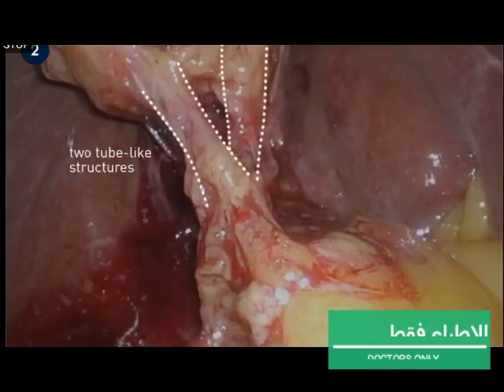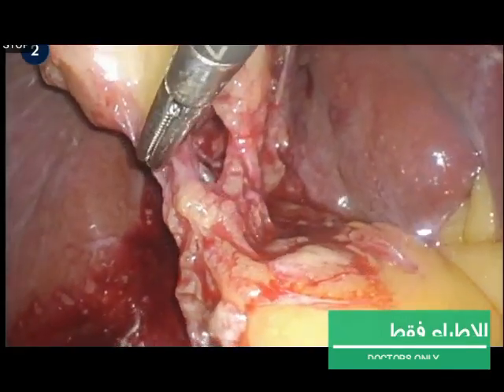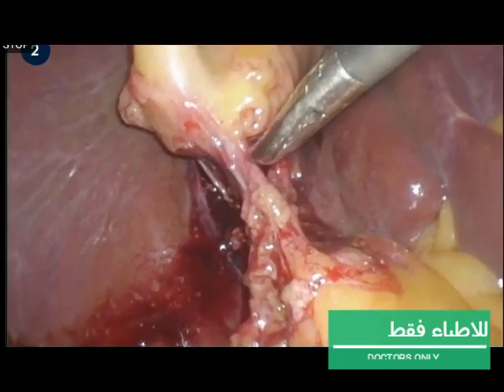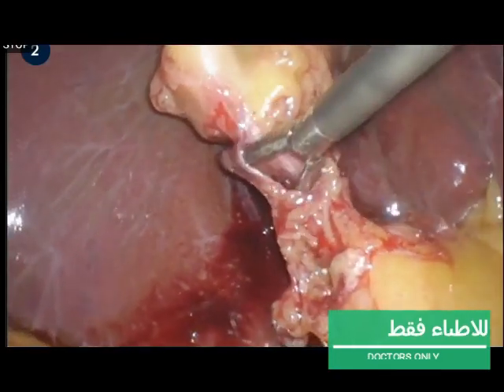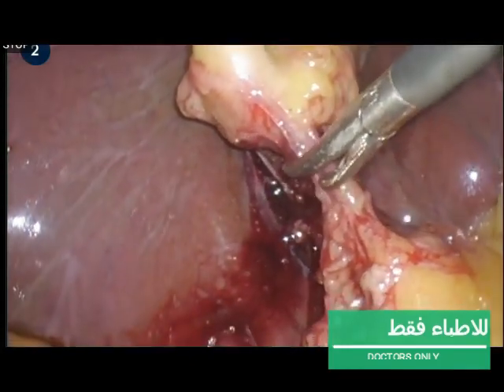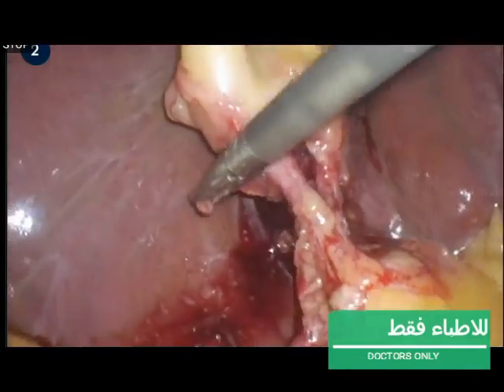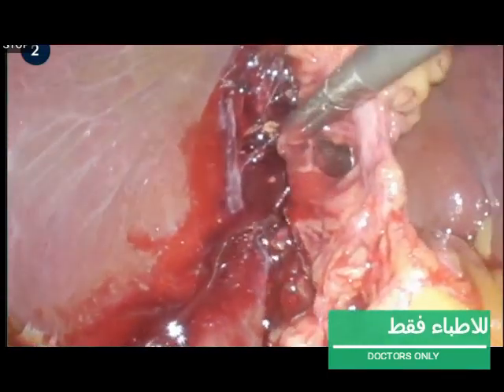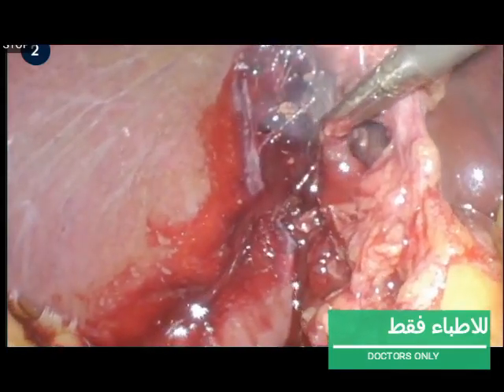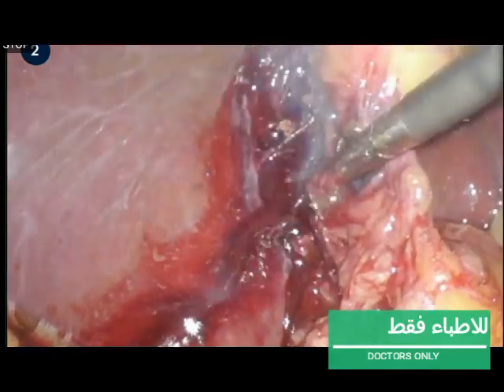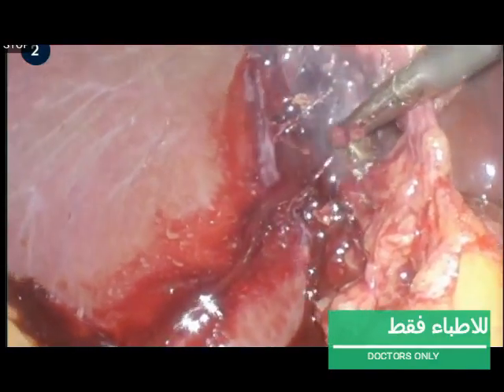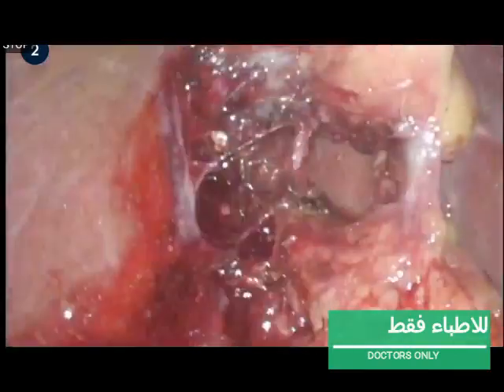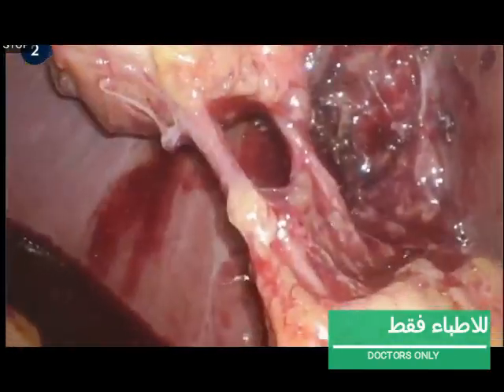This overview shows two tube-like structures. A great variety of biliary and vascular anomalies may occur, making the bile ducts vulnerable to iatrogenic injury during cholecystectomy. This is why it is necessary to identify the critical view of safety. The critical view of safety is defined as the isolated cystic artery and cystic duct entering the gallbladder, with liver tissue in the background and no other structures in between, the triangle of Calot is cleared, and a minimum of one-third of the gallbladder is dissected off the liver bed.